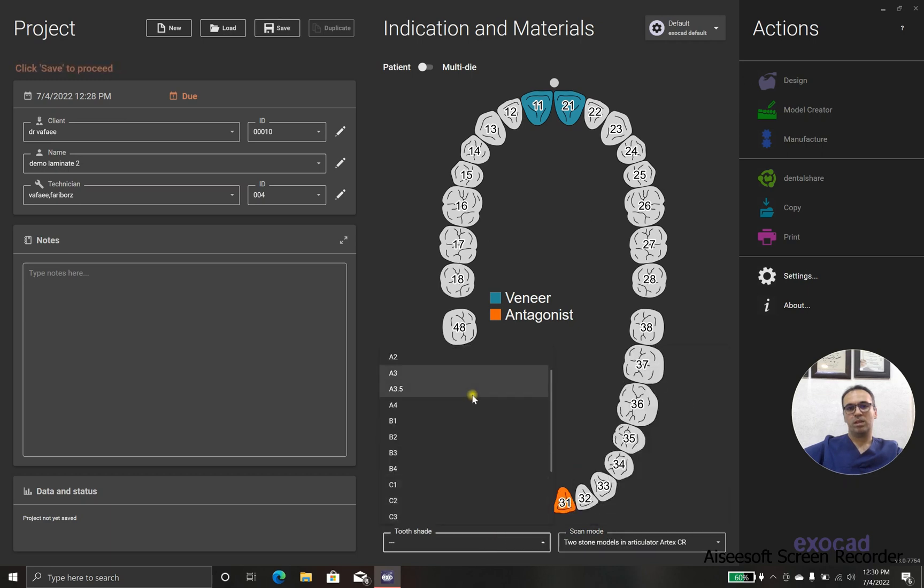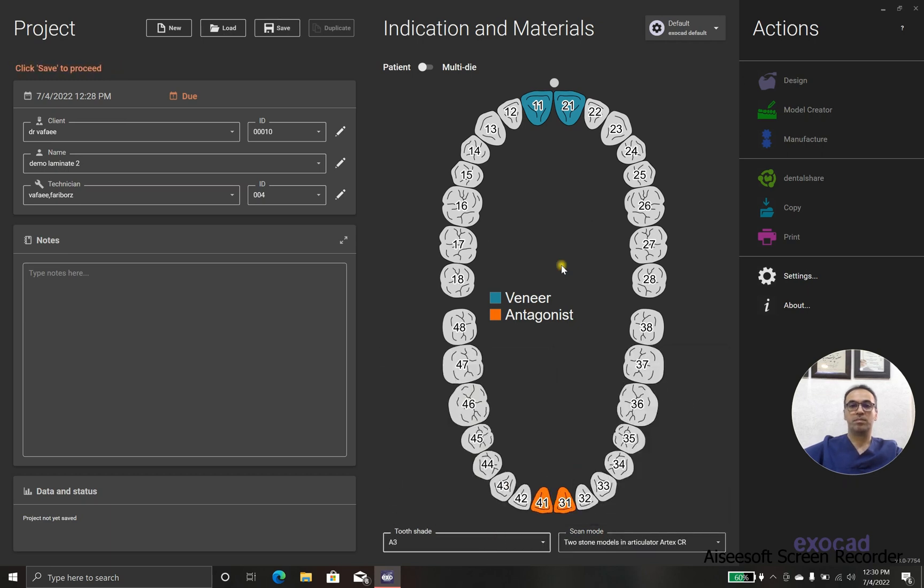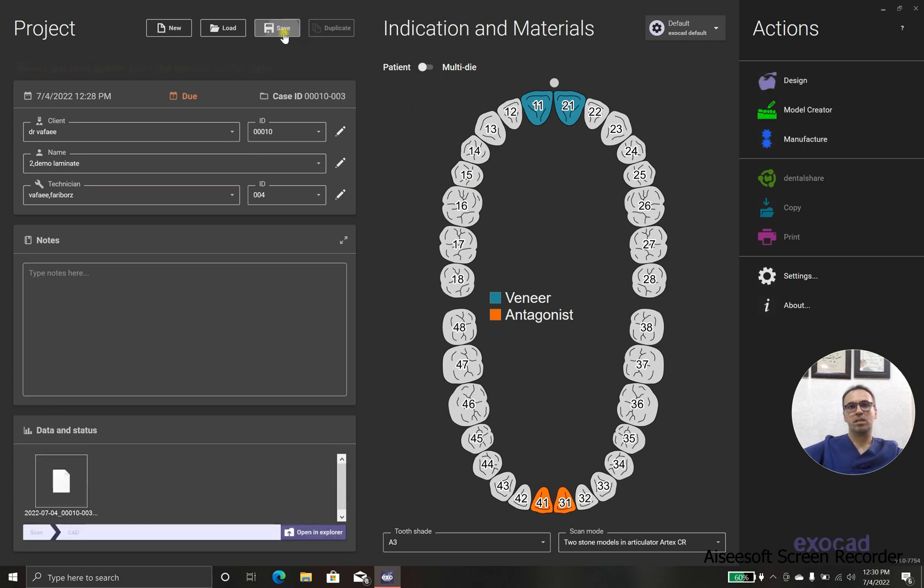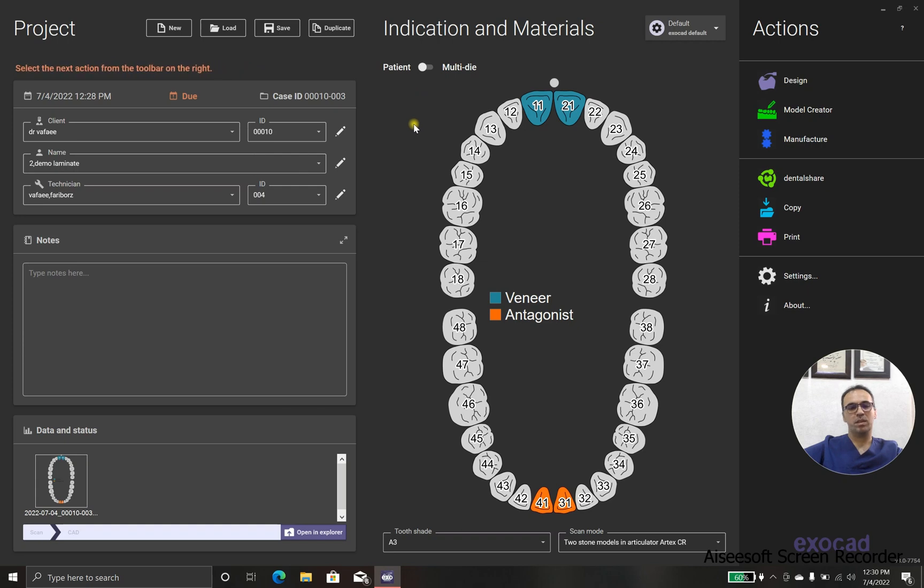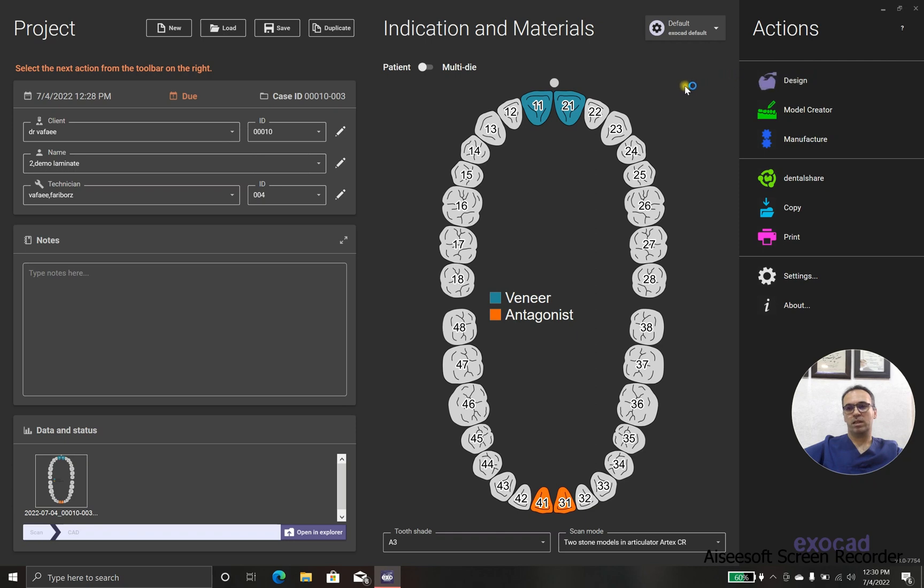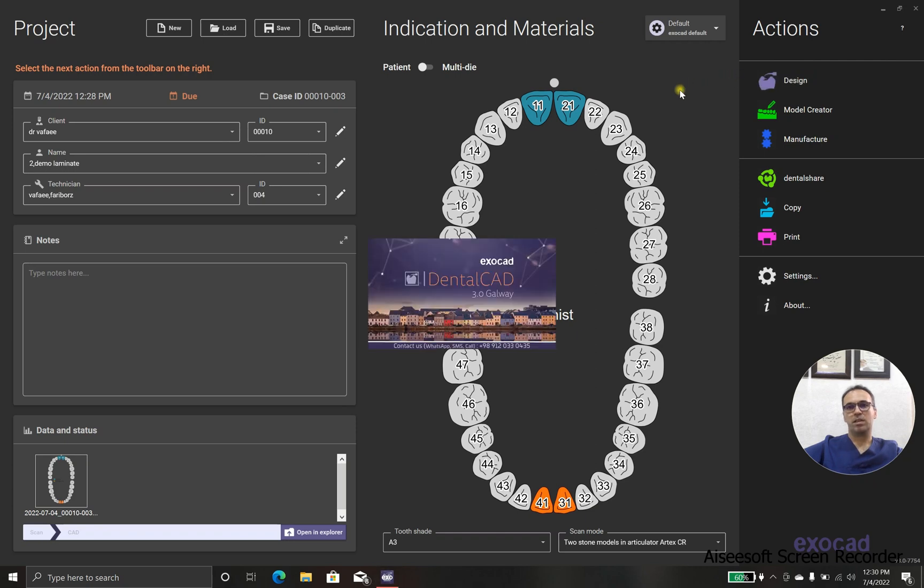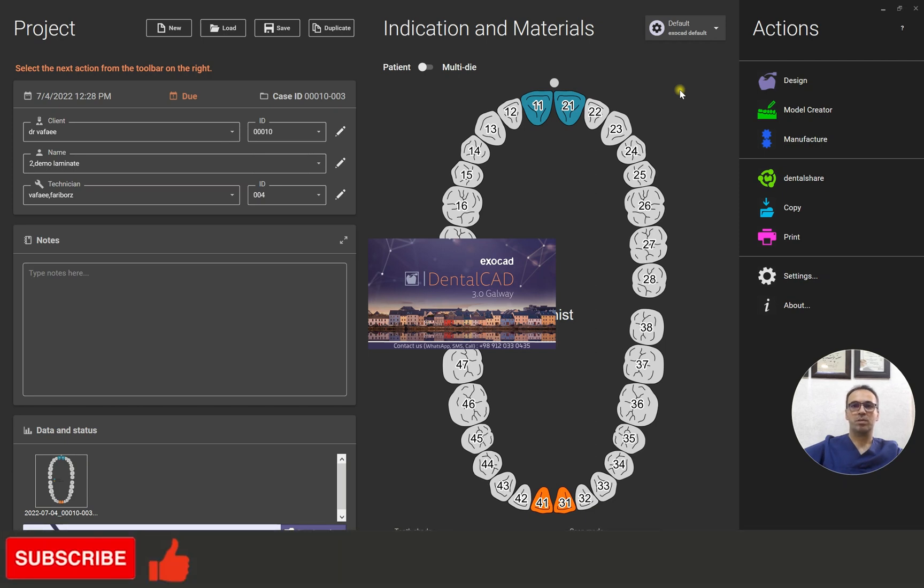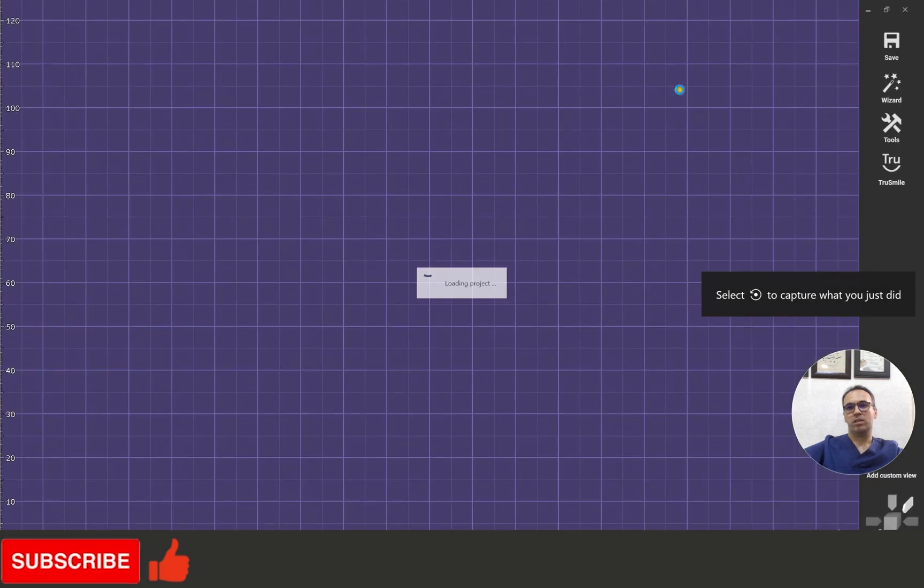One is completely in the buccal side, and one is like a three-quarter crown. In case we have some kind of mesial and distal fillings or extended caries in mesial and distal, it's better to extend the preparation to lingual.